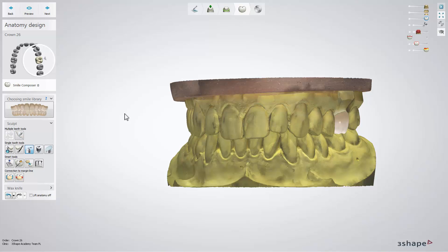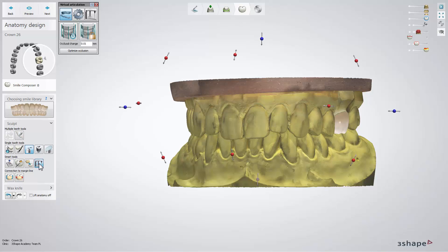This allows restorations to be created with dynamic articulation, reducing the amount of manual work. To activate the virtual articulation window, click on one of the articulator icons located in Design Tools or Viewing Tools.